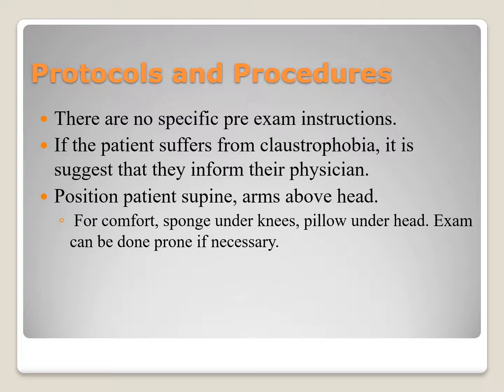Typically for positioning, the patient will lie supine with arms extended above the head. Feet first or head first is the preference of the technologist. Just remember to set the correct parameters in the computer so images are labeled properly. Try to make the patient as comfortable as possible to help avoid movement. Other patient considerations are to have the patient prone if lying on their back is uncomfortable. Arms can also be down by the side but is not preferred because of the extra dose and superimposition.